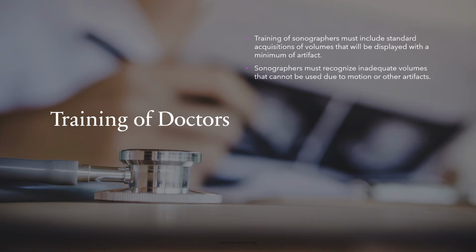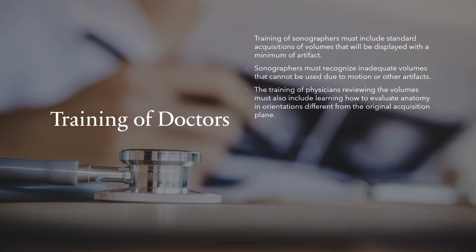Training physicians who will be reviewing the volumes is also essential. Physicians must be taught how to evaluate anatomy from orientations different from the original acquisition plane. Unlike 2D imaging, 3D ultrasound allows for viewing structures in a variety of planes, and physicians need to be trained in how to interpret these views to make accurate diagnoses.